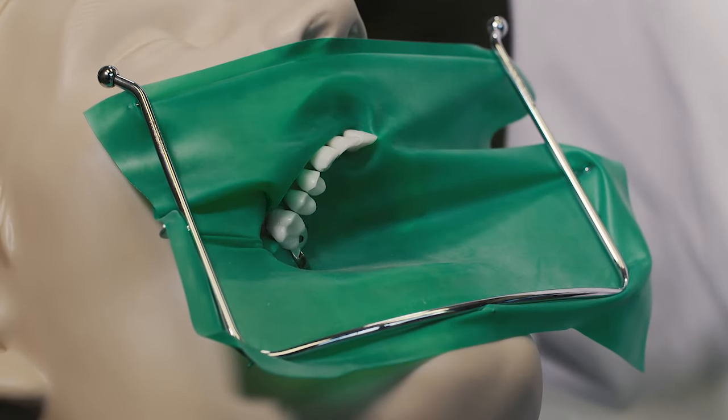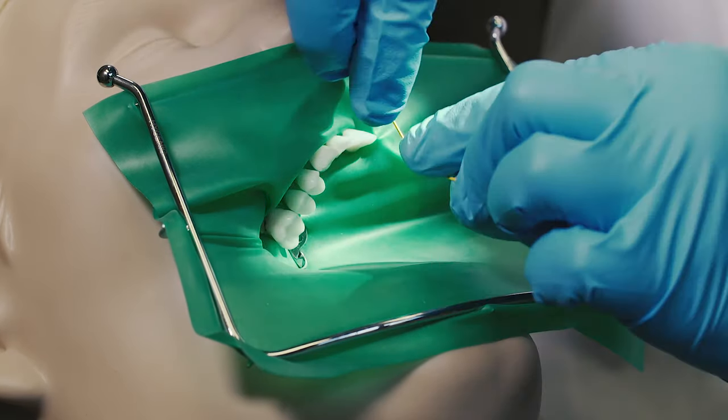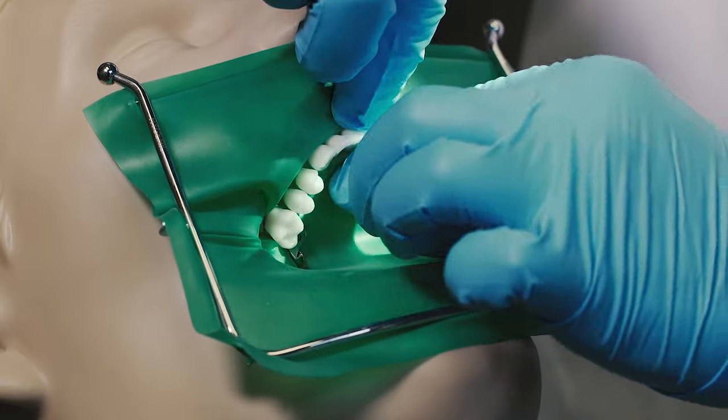A final step would be to hold the rubber dam on the contralateral side with a wedget.